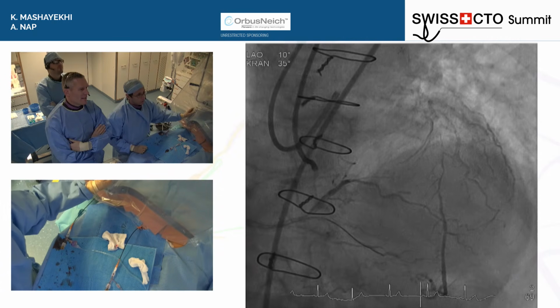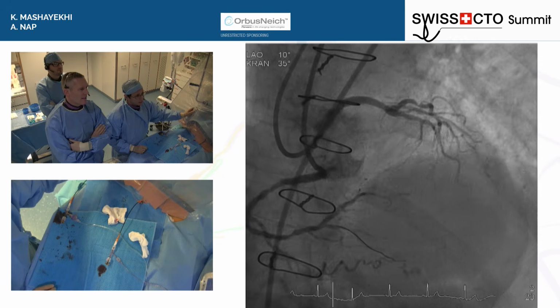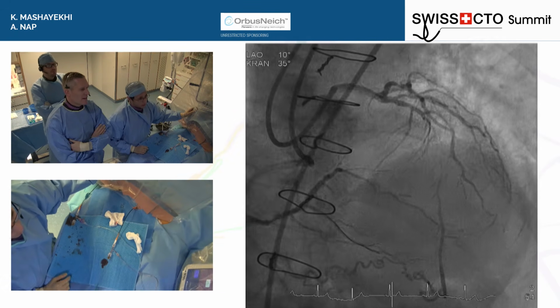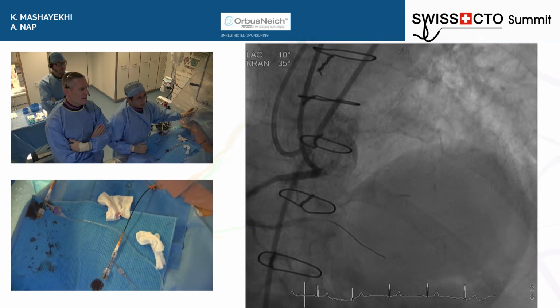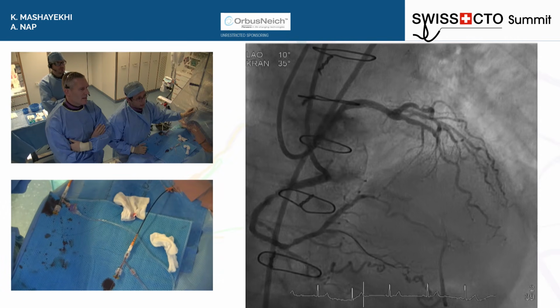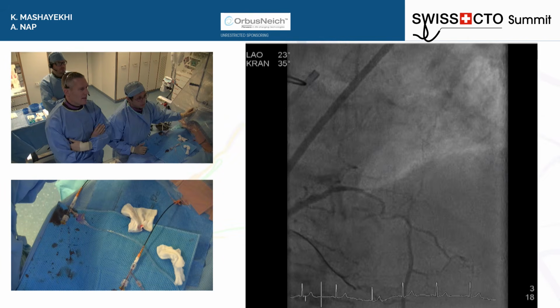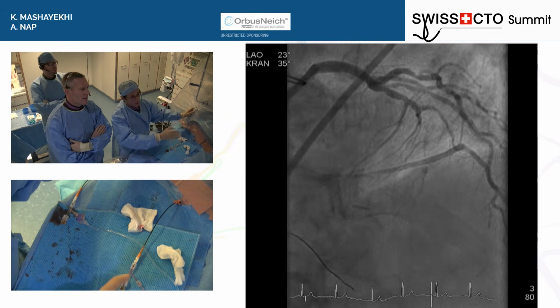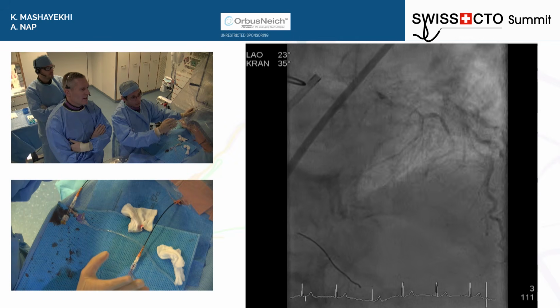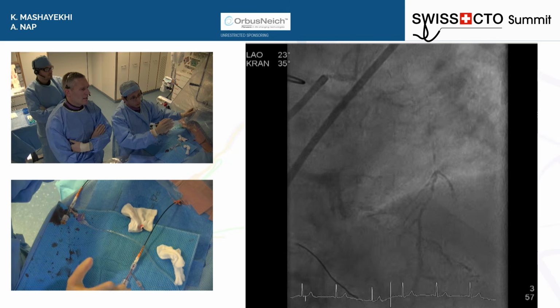So therefore, all the strategy is more and more based on good antegrade wire skills, or I think, but we can have this discussion open. There's a retrograde filling, and we didn't understand initially the antegrade cap. So therefore, we did a little bit more angulation. And there's also some line left of the artery, and you may think that this is also contrast, but I don't know what it is.